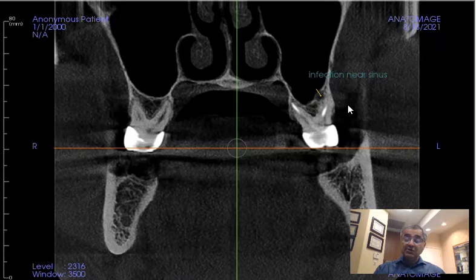Now, a 2D X-ray, a regular X-ray, only picks up the most dense structure. So it cannot see defects unless that defect is all the way through the bone and tooth. So with this, we were able to see behind the tooth. In the past, when we couldn't see this, we would tell the patient to return after they could figure out exactly where the pain was coming from.